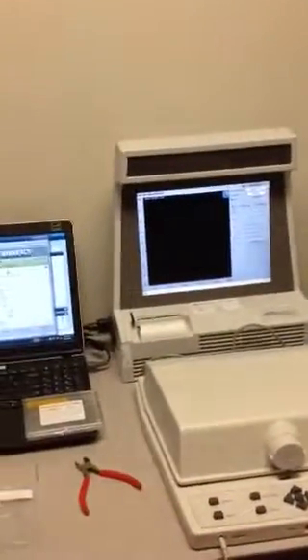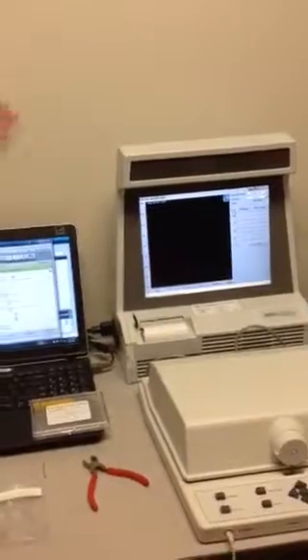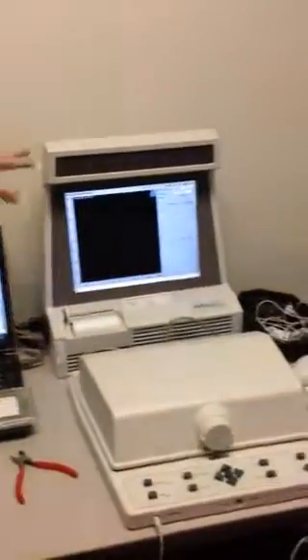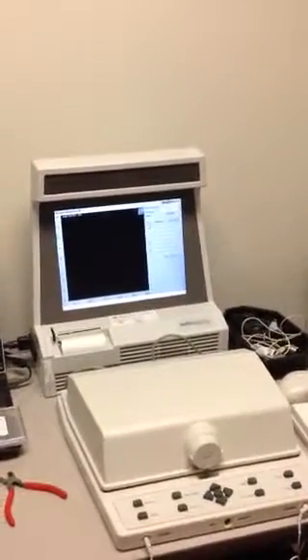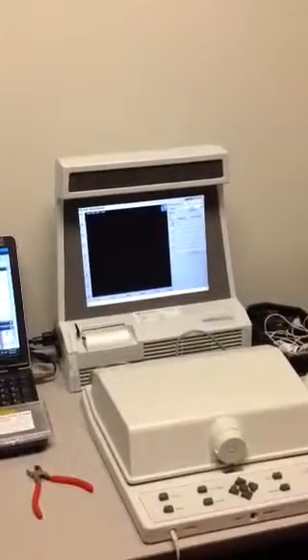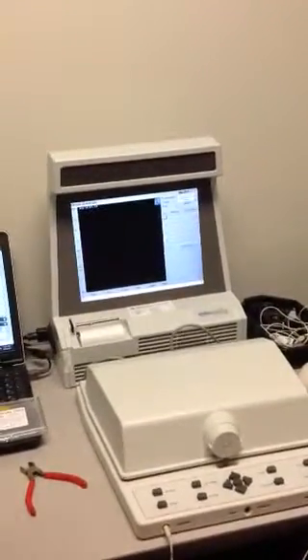Alright, so we have to estimate, with the VeriFit for proper calibration, your patient can be 18 to 36 inches from the speaker. So she's probably about the 3 feet mark. So that means when I connect the directional rear microphone, I need that to be also 3 feet from the back of her head. So the directional mic plug-in is right here.